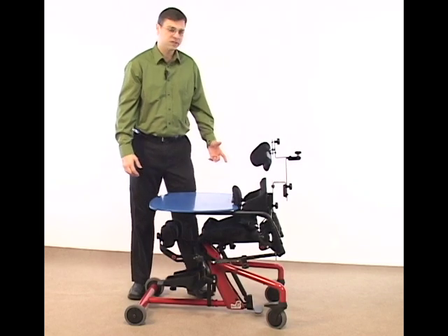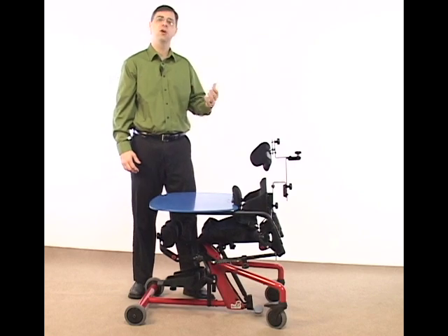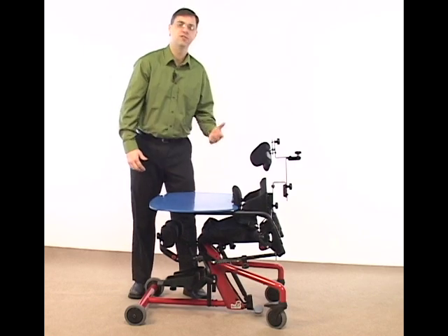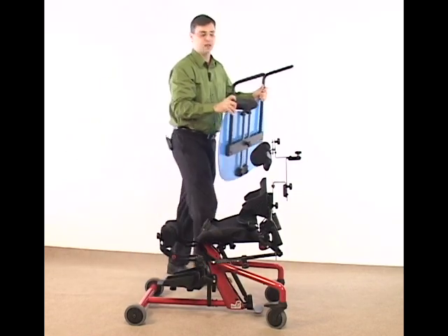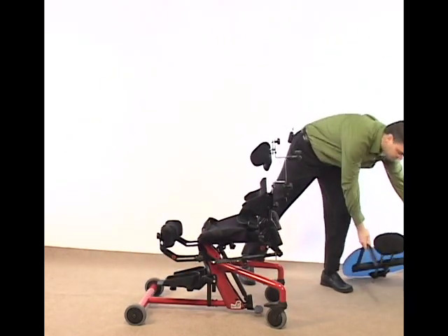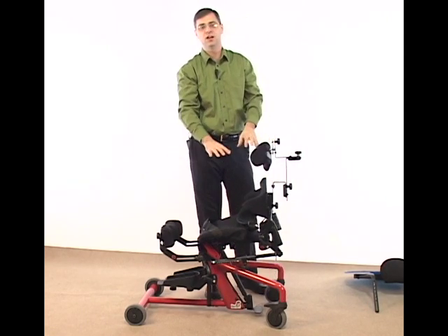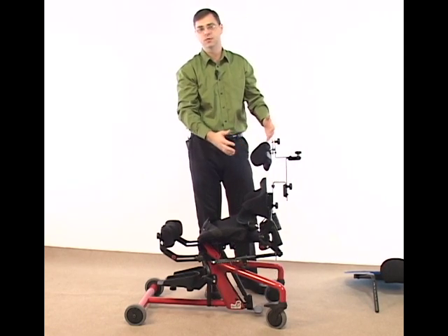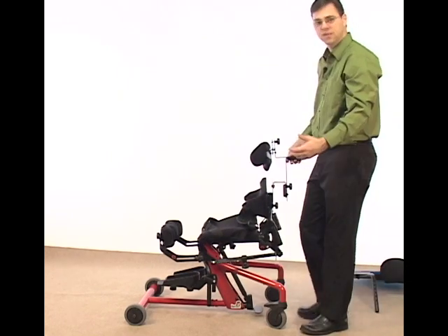Let's take a closer look at adjusting seat depth. When adjusting seat depth, we want to do this before the child gets into the unit. To make this process as easy as possible, it's always a good idea to remove the shadow tray if you have it on your Easy Stand Bantam. The shadow tray adds weight to the front of the unit, so by taking it off, it's going to make your seat depth adjustment much easier.